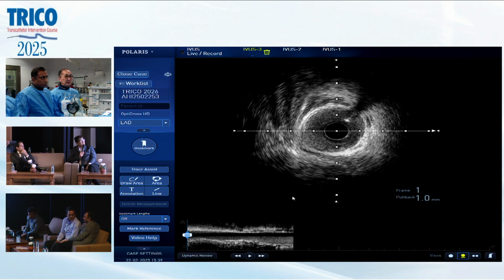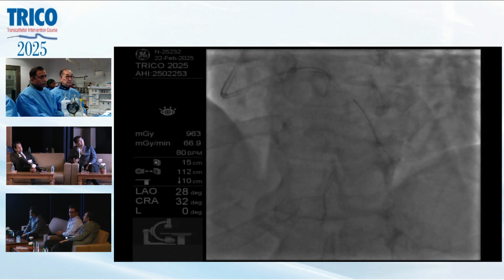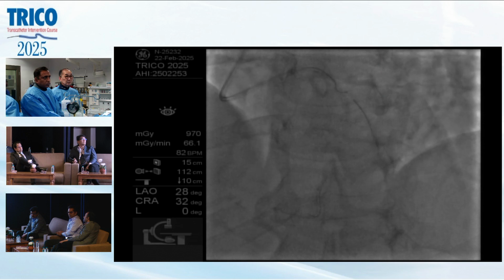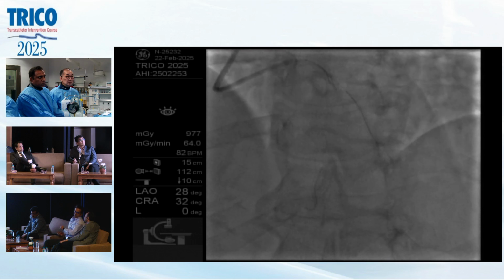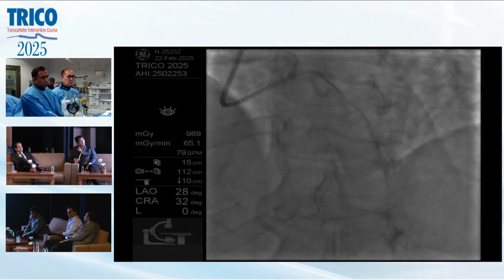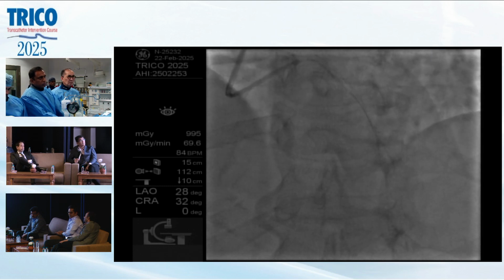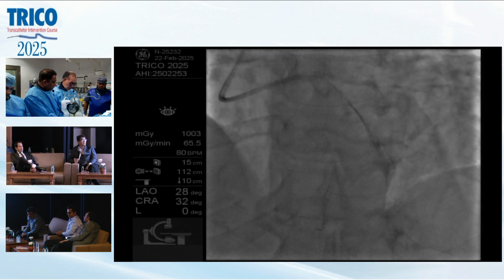Can we see the live fluoro, please? Can you get a live photo? We can see it now. Okay, so the side branch is up.